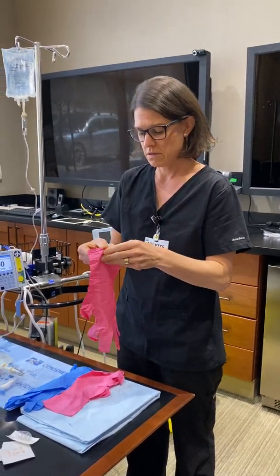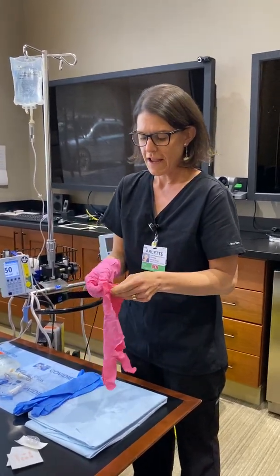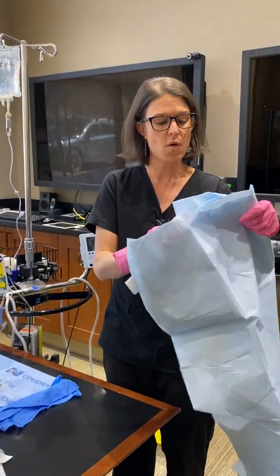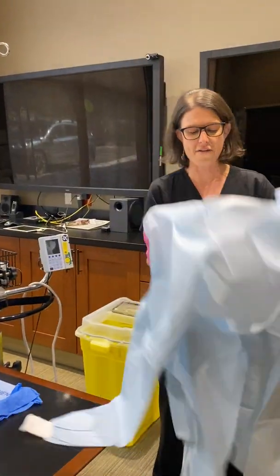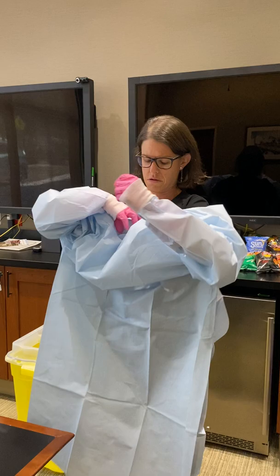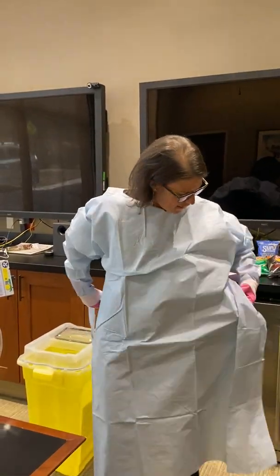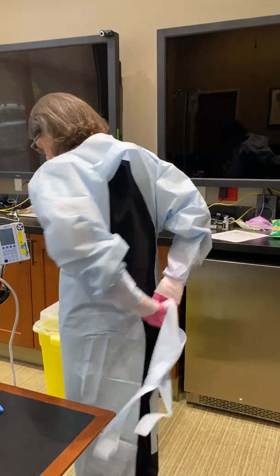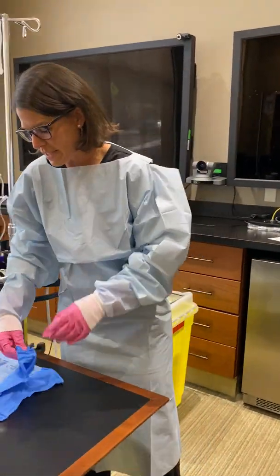With the pink gloves you'll want to put those on first, and then the chemo-certified gowns — it just depends on what we have in stock. Some of them go over your head, some of them tie around the neck. These ones that we currently have happen to go over the head. You'll put that on and then there is a tie in the back. After you have your gloves and gown on, you'll put on your second pair of gloves.